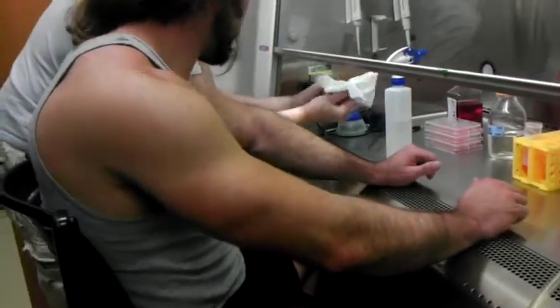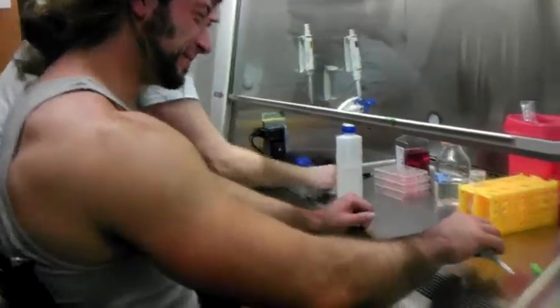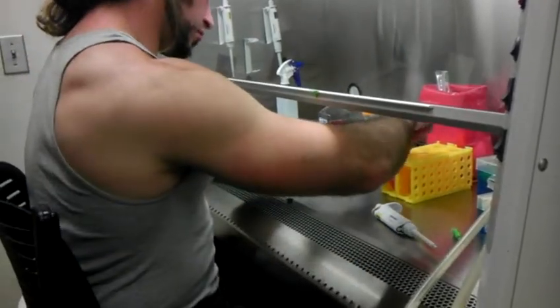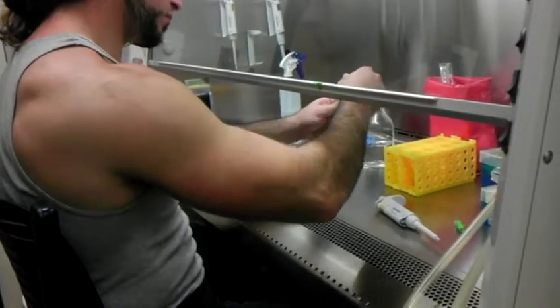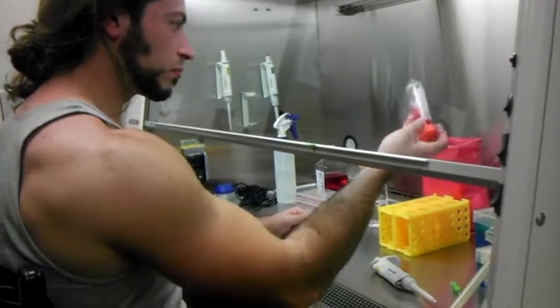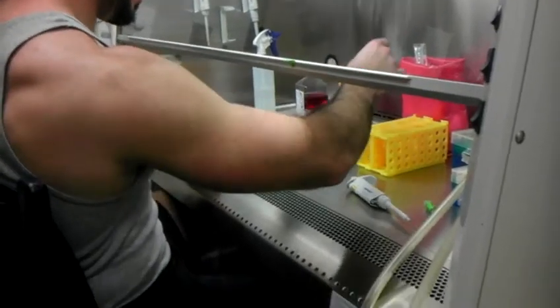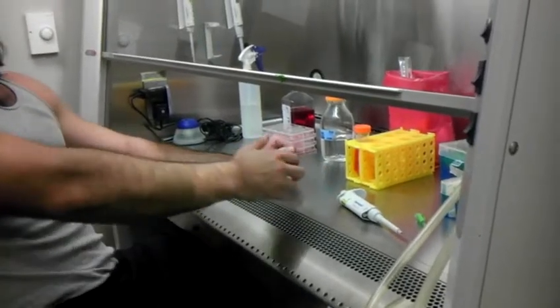Good enough for science. Close up that container, and then shake it with your hands up and down a couple times. There you go. Not too viciously. Nice and easy. That's good enough. Very nice. That's right there.